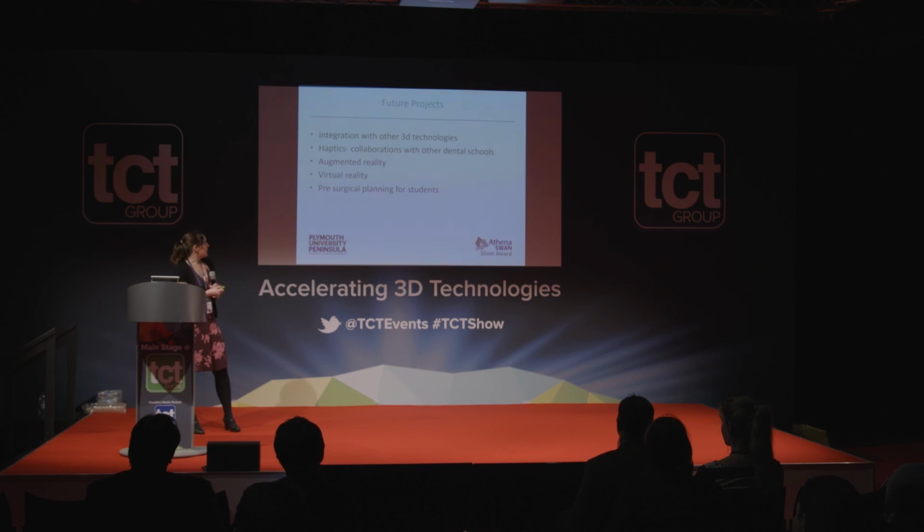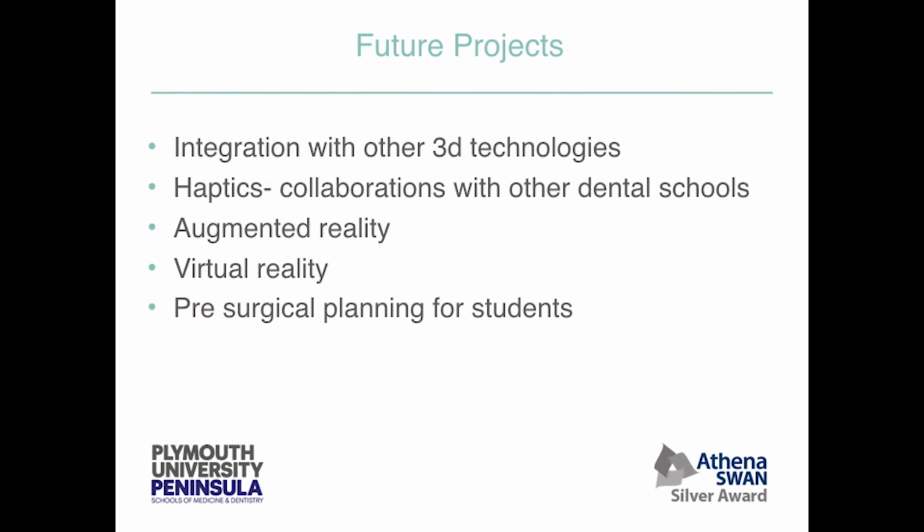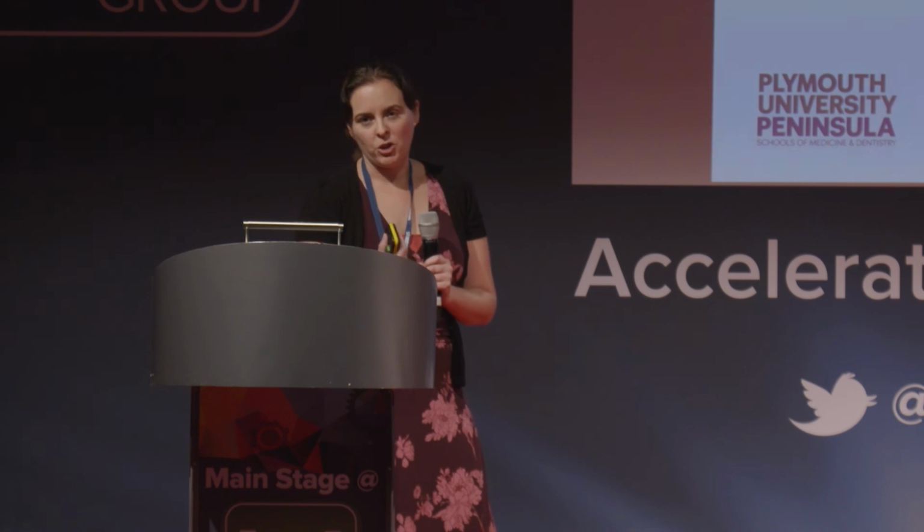And I think where we'd like to go eventually, and I know other dental schools are looking at this as well, is pre-surgical planning for students. So it would be great if our students can scan their patient's teeth, upload that to the haptic machine, have a go on it, practice the procedure haptically, then 3D print the models, put those models into the phantom heads, practice them again, and then when they're happy, go and do it for real on their patients. And every time they do it, they can get feedback and suggestions on how to make improvements from their tutors.